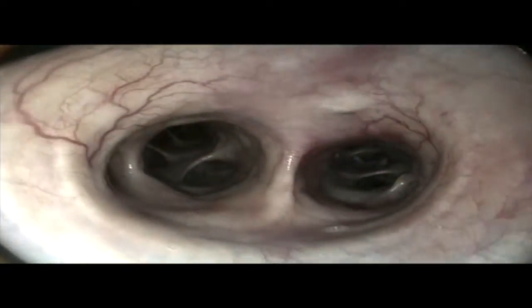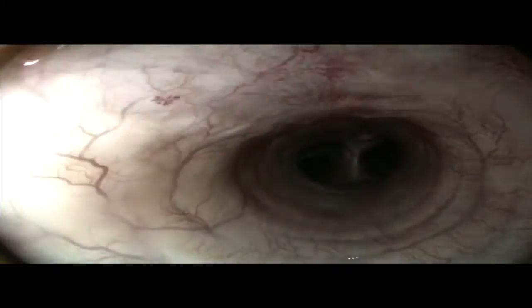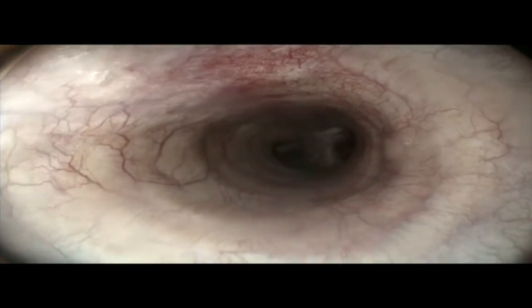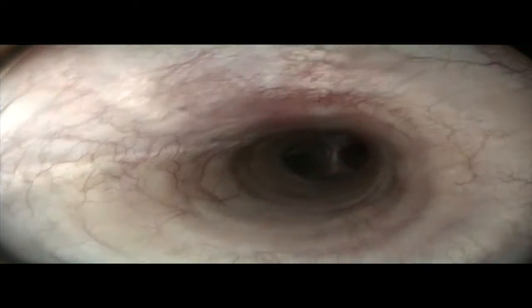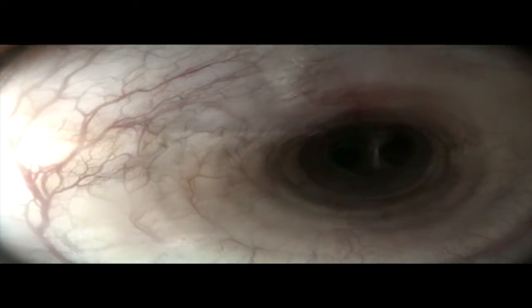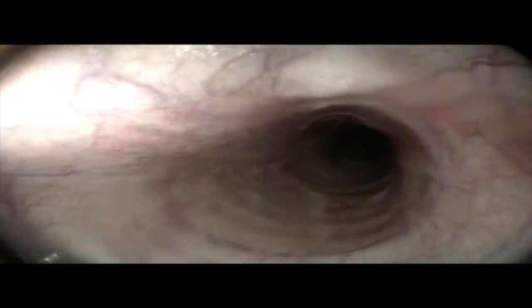As you can see in the endoscopic examination in clinical cases, tracheitis is very interesting because you can see different kinds of inflammation. You can see fluid into the trachea, and of course it is very important to take a biopsy for cytology or morphological tests from the trachea. Endoscopy is a very interesting method in clinical cases with tracheobronchitis. Thank you very much.